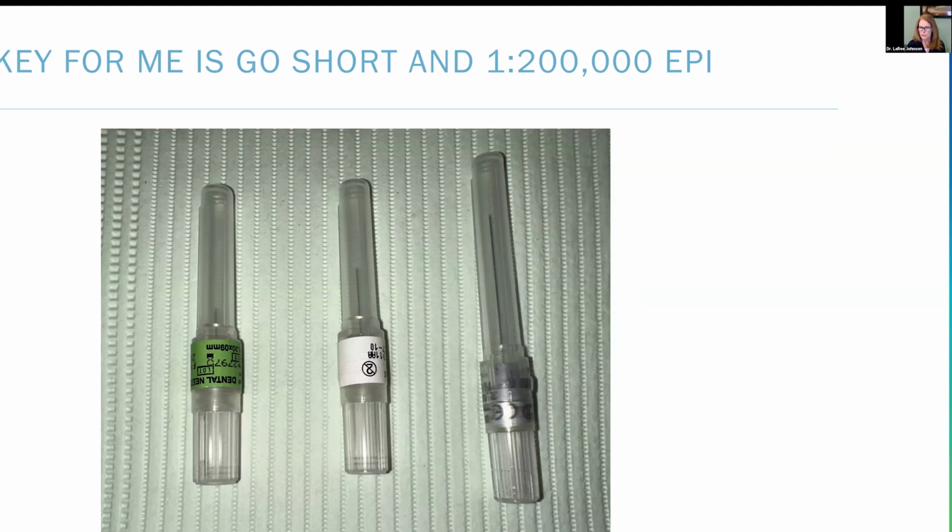And if you're still using your device conventionally, so for example, back in March of 2023, I would use the device to deliver a block if I was taking out a permanent lower molar. But now, as the book said, to use the 16, the white, it says I need to use this for permanent dentition, and I had a lot of bends. Now I use the green for everything. And I intend that if it's an older child, I am actually doing intraseptal and I'll inject in more than one place. But you can use these conventionally.